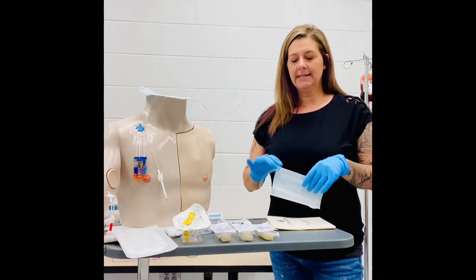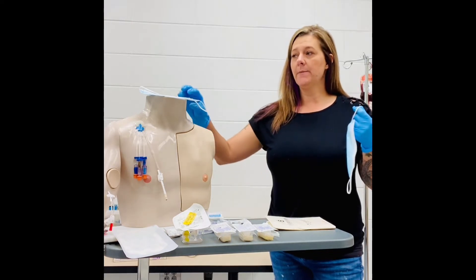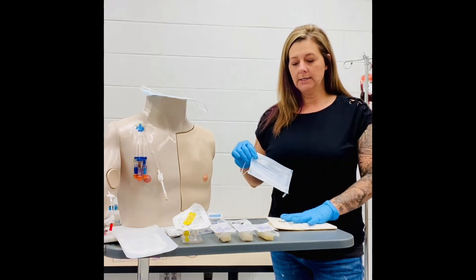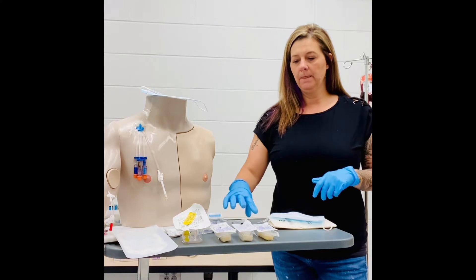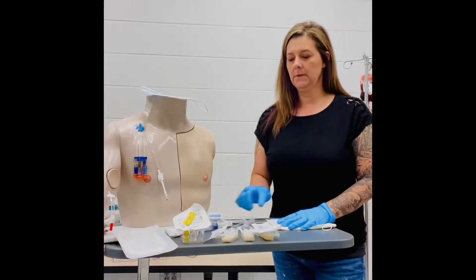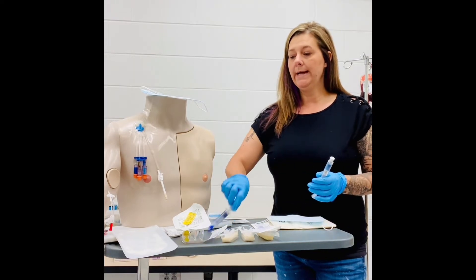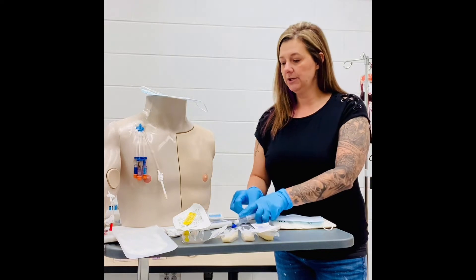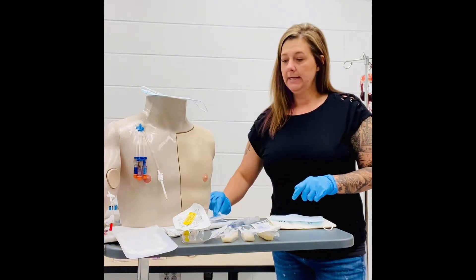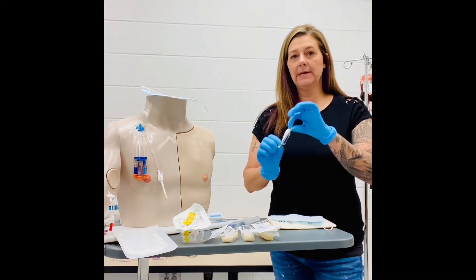For PortaCath access, we need to wear a mask during this procedure, and our patient also needs to wear a mask. We need our sterile gloves, clean gloves, three chloropreps, a Huber needle, our 10 ml normal saline, and we'll also possibly need our heparin flush. We need a bio patch, a Tegaderm, and a cap for the end of the Huber needle.